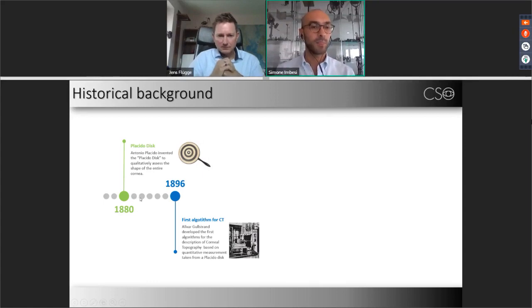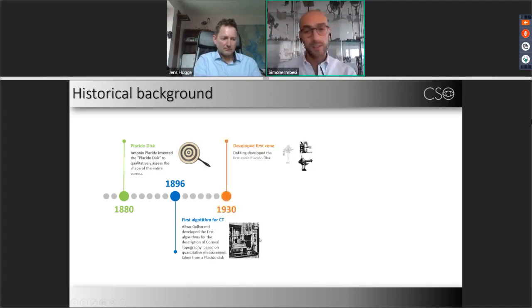Then, in my opinion, one of the most important steps was in 1896, where, thanks to a study of Allvar Gullstrand, an algorithm was developed to take a measurement from the Placido disc. 30 years later, Dekking developed the first conic Placido disc, so a Placido disc that has a shape more similar to the one that we see nowadays in topographers.